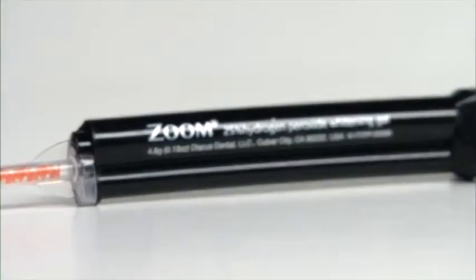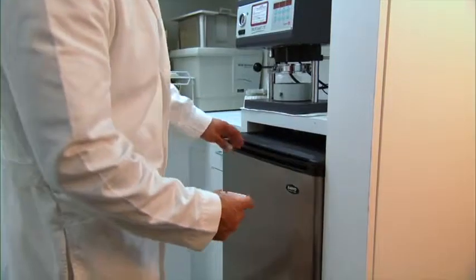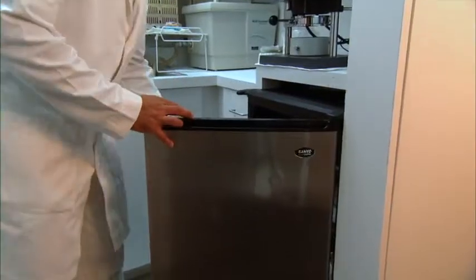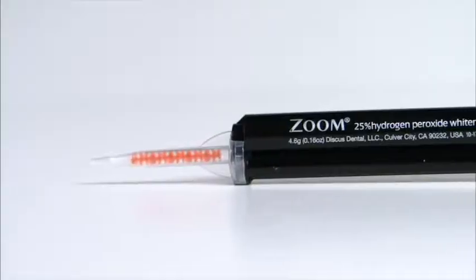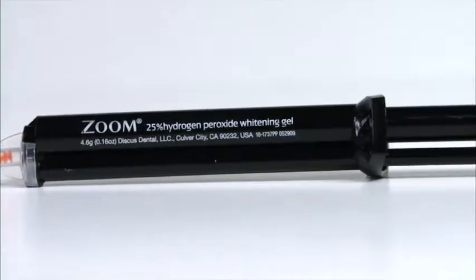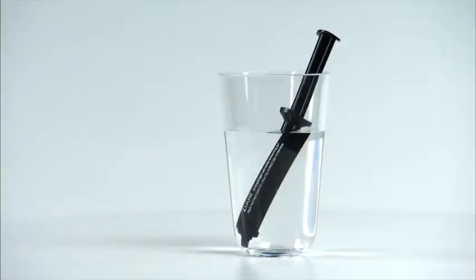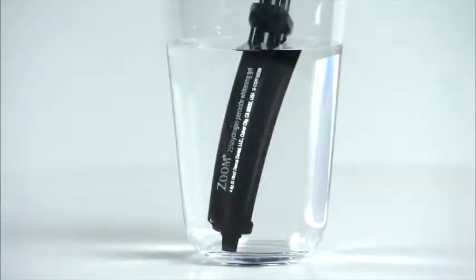The Zoom whitening gels are packaged separately from the treatment kits. To enhance shelf life, refrigerate the syringes. The gel must be returned to room temperature before use so it won't become runny. This can be done by either leaving the syringe out overnight prior to the appointment or placing the syringe in a cup of hot tap water for 10 minutes. Be sure to remove the syringe from the water 5 minutes before use.